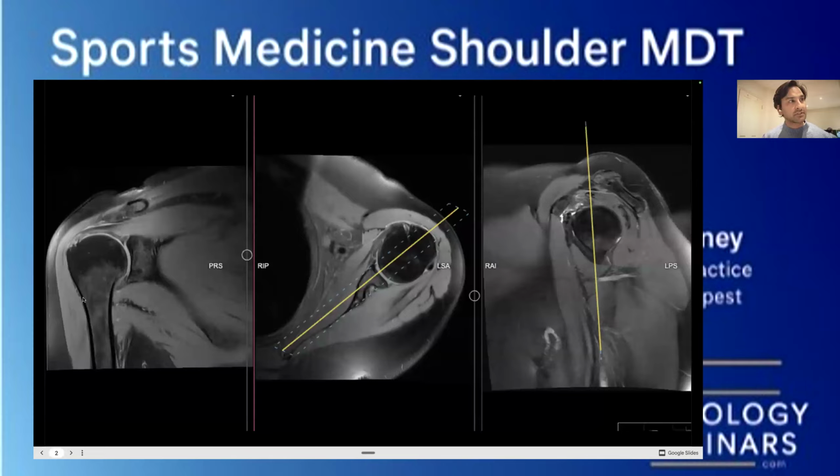But what you'll also notice, I've got this very dark black outline, right, all the way around like so. So there are certain areas here that are very, very black. If you're not entirely sure what that is, think back to your anatomy. What is at the surface of every bone? It's cortex, right? Cortex is at the surface. Cortex doesn't have a very big blood supply, not particularly fatty, very, very calcified.